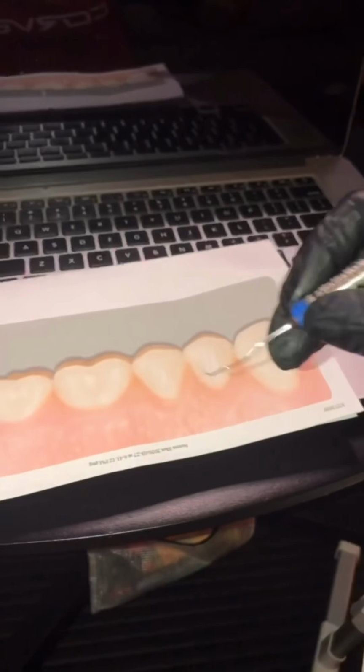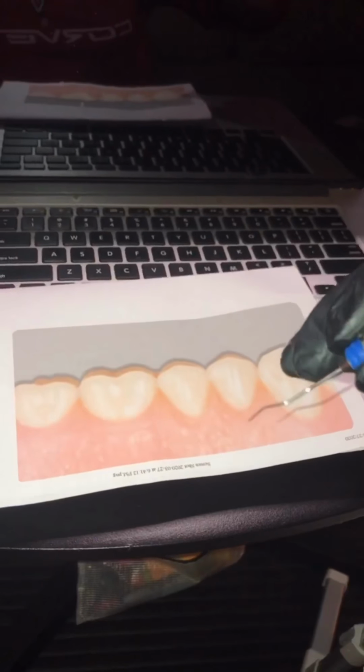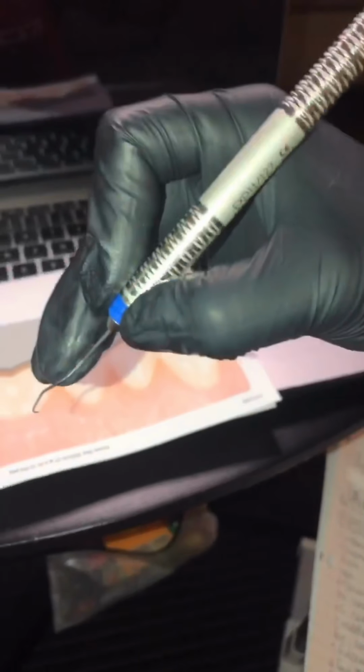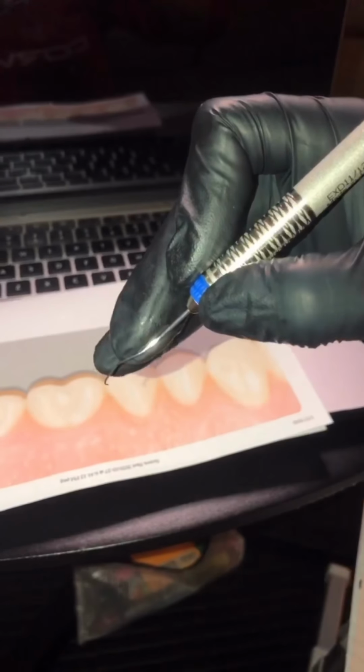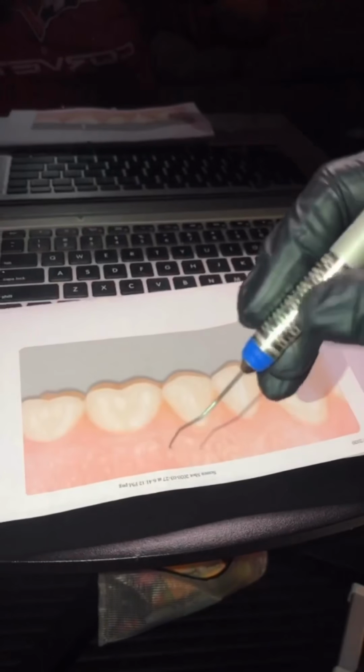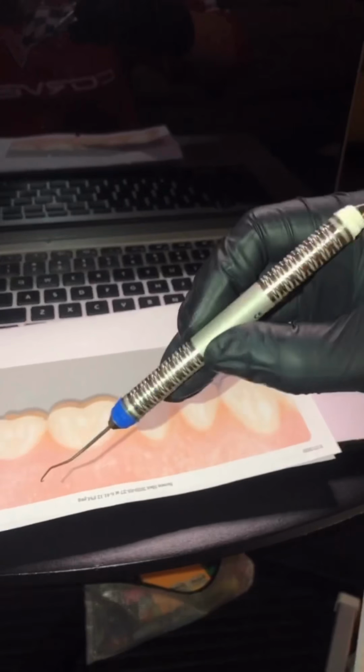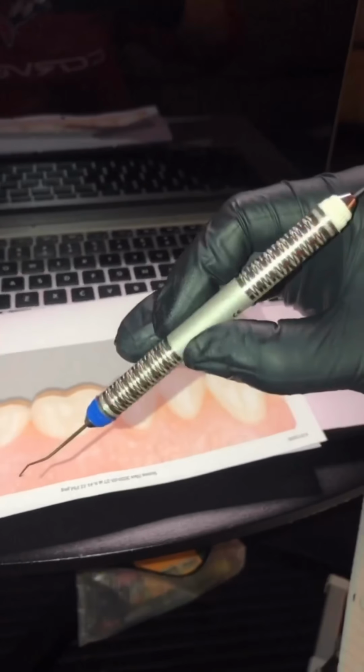Checking in with our modified pen grasp, we want to make sure that we have our correct working end now. You want to make sure you have your light C, you have your tactile sense middle finger, and then you have your fulcrum. For posterior, it helps to telescope your instrument out. So you might need to make sure that you're a little bit further out.